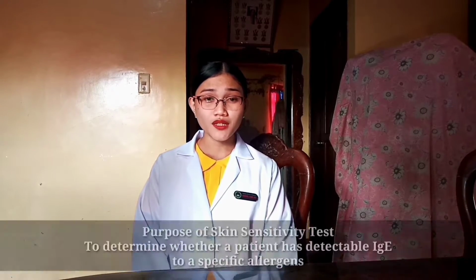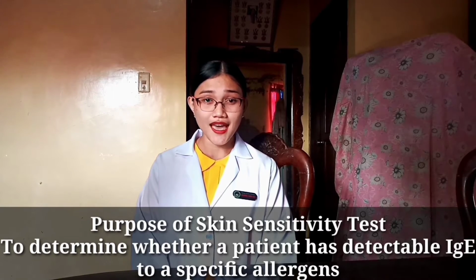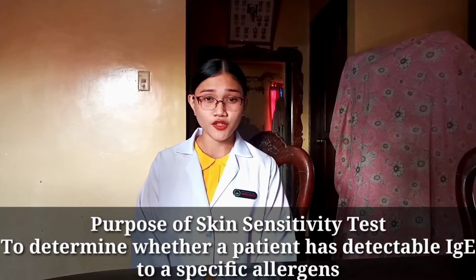So first, we will need to know what is the purpose. The purpose of skin sensitivity test is to determine whether a patient has detectable IgE antibodies to a specific allergen. The skin sensitivity test has two results. We have the negative and the positive results.